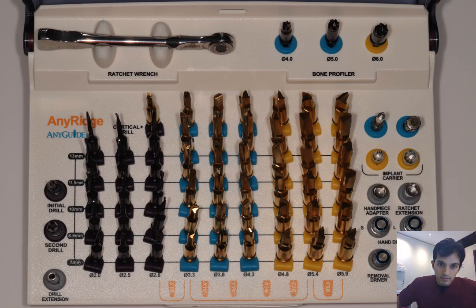As I mentioned, this is the R2 Gate surgical kit. This particular kit I have is for the AnyRidge system. However, I know that they make this for all the different systems in the Megagen family, as well as for all the other major implant manufacturers out there, and the universal kit as well.